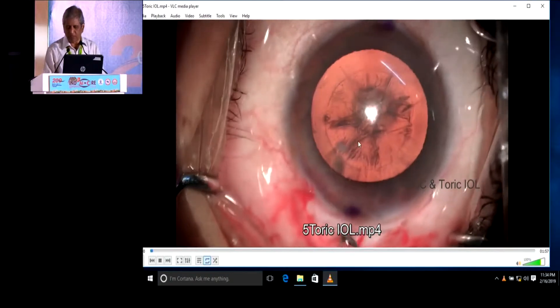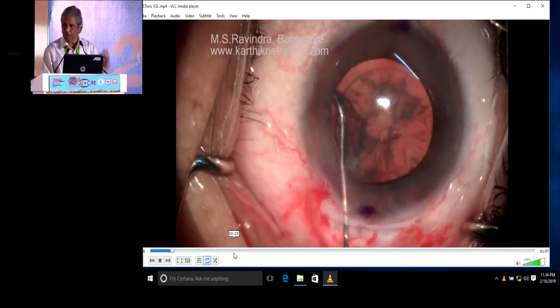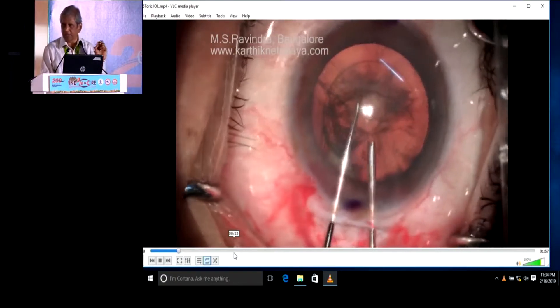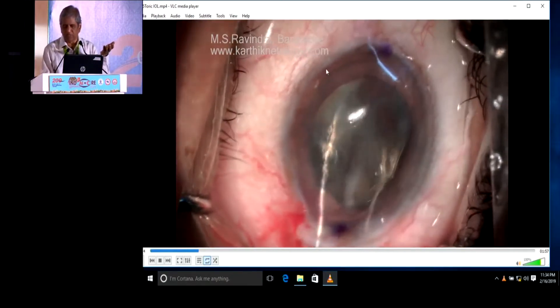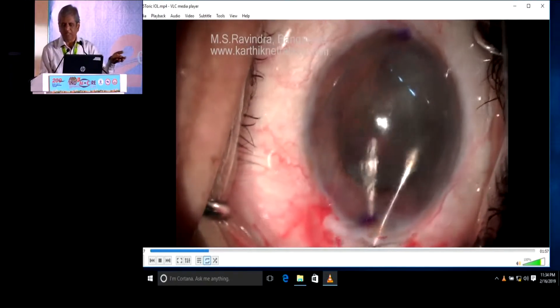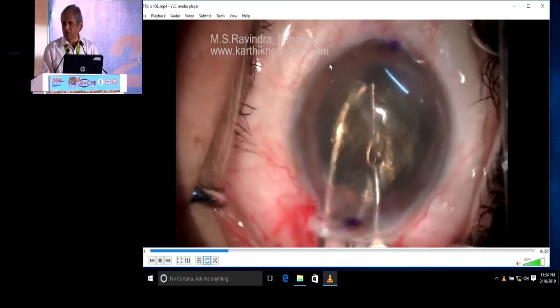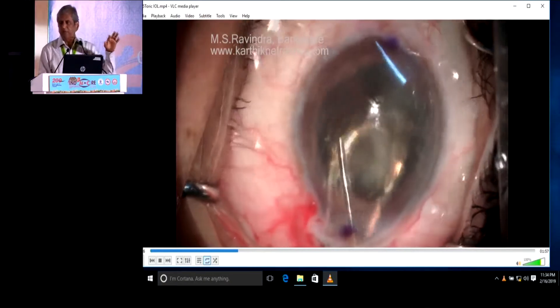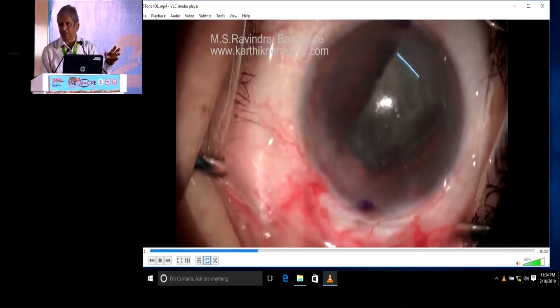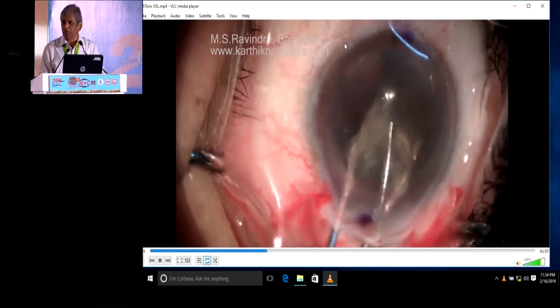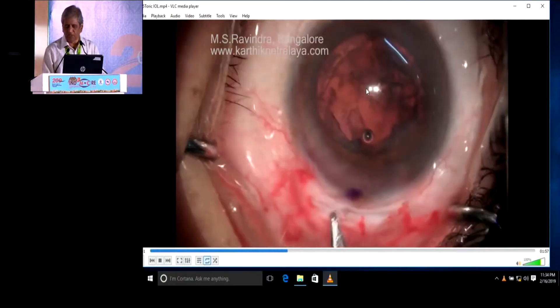Toric lenses are the other option. You've got a perfect rhexis. Hydrodissection — you have to make a capsular separating hydrodissection. Never inject in front of the anterior capsule, because the fluid finds its way through the zonules into the vitreous cavity, increasing the pressure. Even if you have pushed half a drop of fluid through the zonules into the vitreous cavity, you can have an intraoperative hard eye. All intraoperative hard eyes are iatrogenic — they can be avoided by avoiding injection through the zonules.